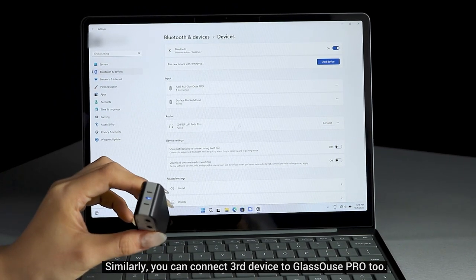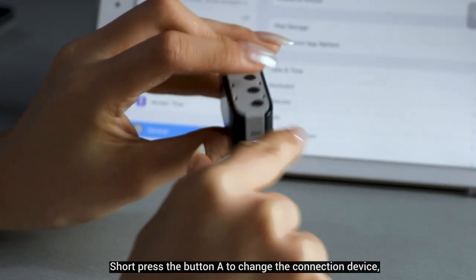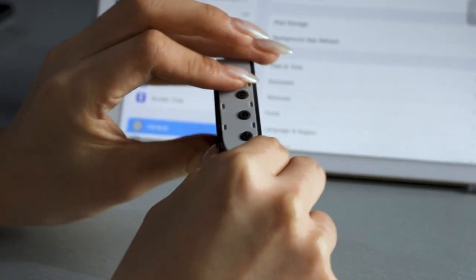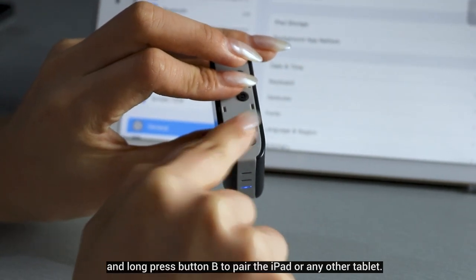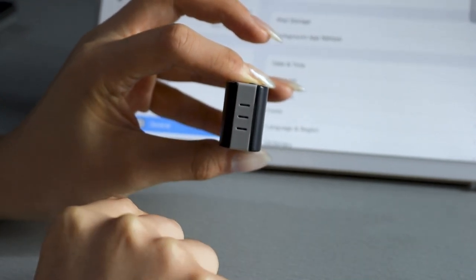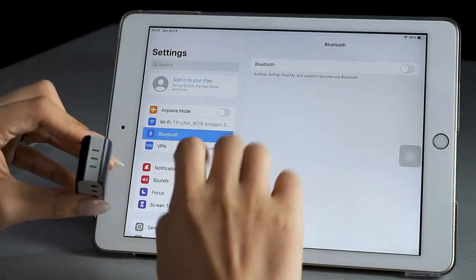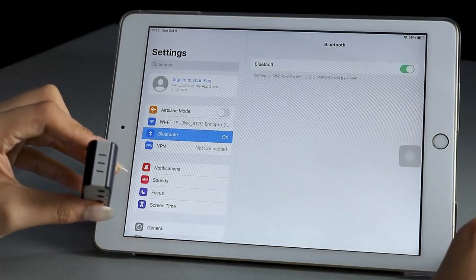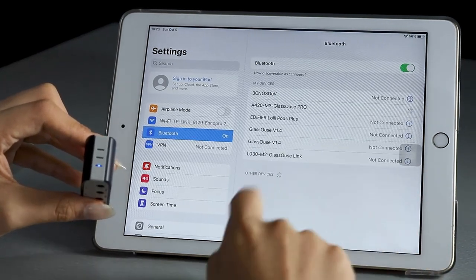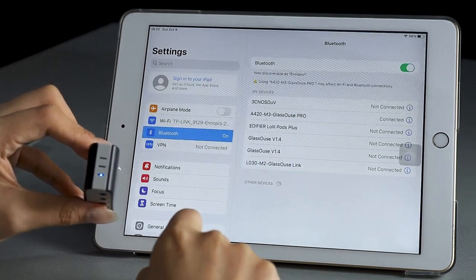Similarly, you can connect a third device to GlassOuse PRO. Short press button A to change the connected device, then long press button B to pair an iPad or any other tablet.